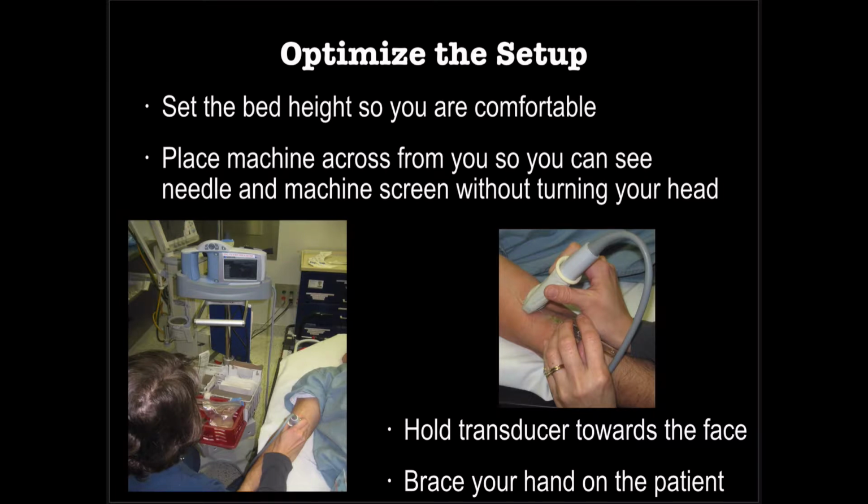The other thing to know about using ultrasound, if you're just doing an abdominal ultrasound, you can set up however you want. It's really not good, but you're really only going to be doing it for a couple of minutes. So if your positioning is awkward, you're not really going to hurt yourself. A sonographer, on the other hand, that's doing this for 8 hours a day, if they set up wrong, they can get carpal tunnel syndrome and achy back and achy legs. So they always set up right. Us clinicians, you can kind of put it wherever you want.